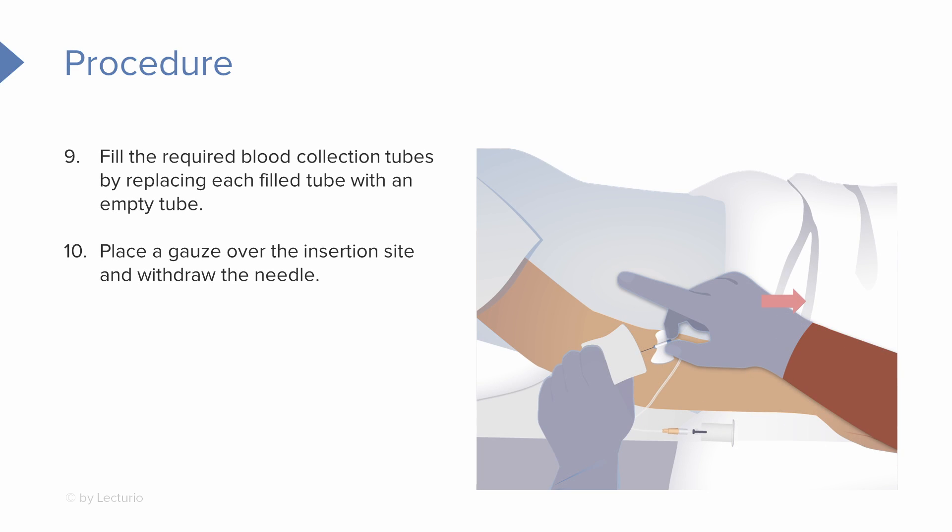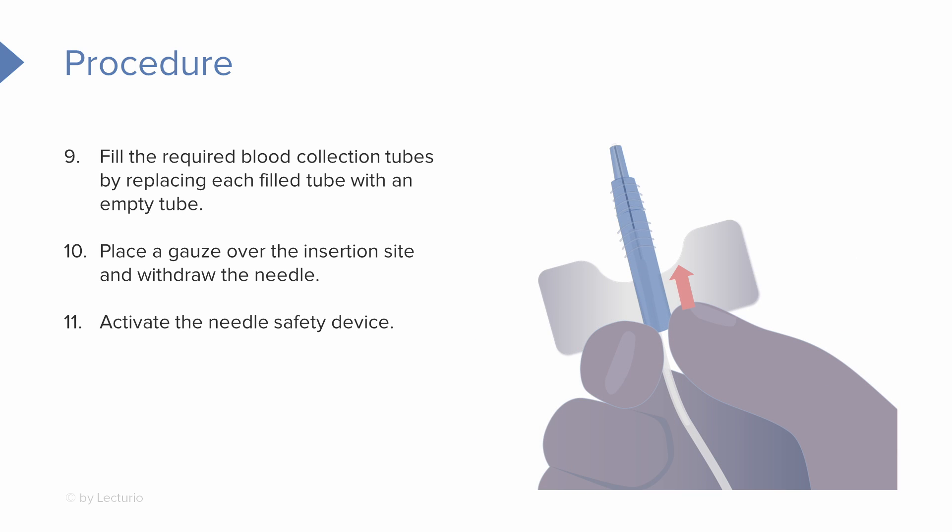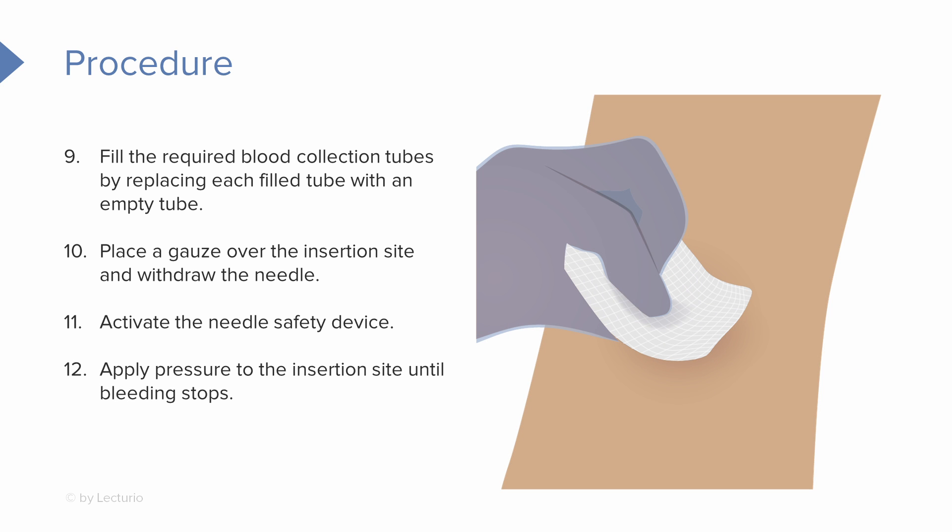Once we've collected all of our labs, we can place our gauze over the insertion site and withdraw the needle. Of course, activate the needle safety device. It's a good idea to hold pressure to the insertion site using that gauze until the bleeding stops.